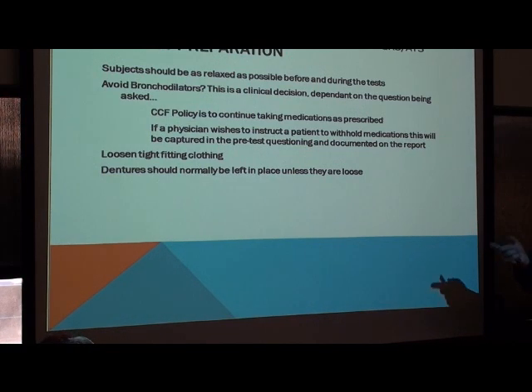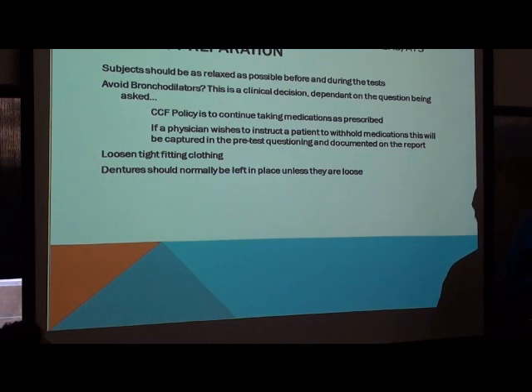Dentures are another thing. I think everybody in the room knows and would prefer to have dentures stay in place during pulmonary function testing. Removing them really disrupts the normal architecture of the mouth and makes it more difficult for the patient to make an airtight seal, certainly using the round standard pulmonary function filters that we use just for spirometry.